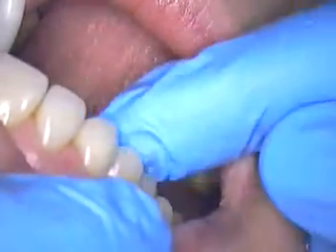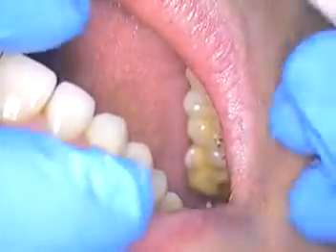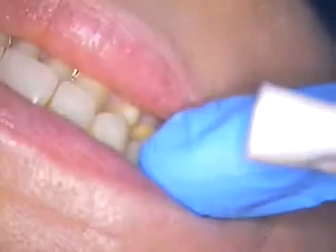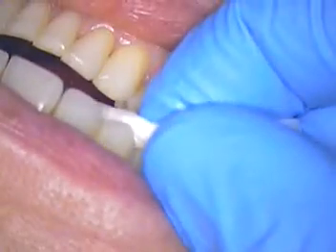In it goes — push it all the way in. And then we put a cotton roll in there, and then Victoria, have her close down, please, just to seed it. Open. Tap, tap, tap. Feels good. Very nice. There it is — cemented. Squeeze down a little bit and hold. About two minutes. That's it.